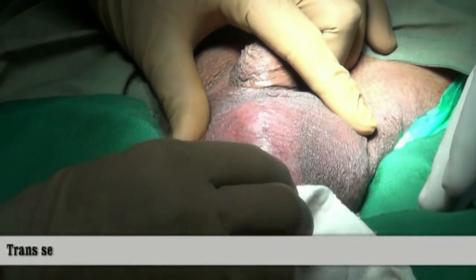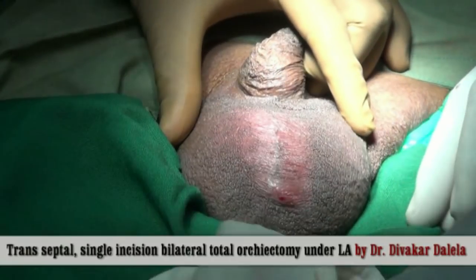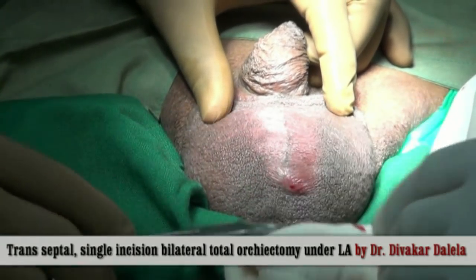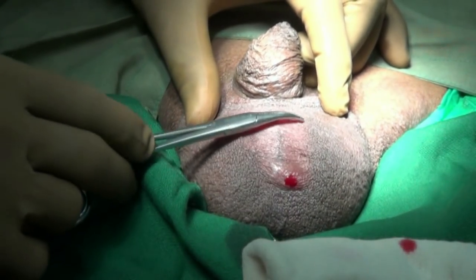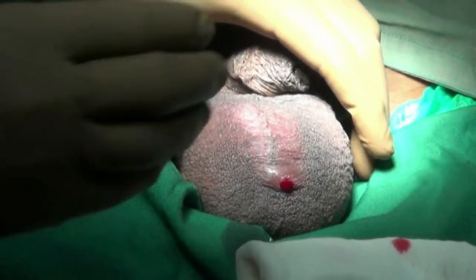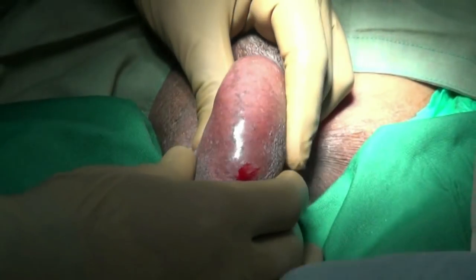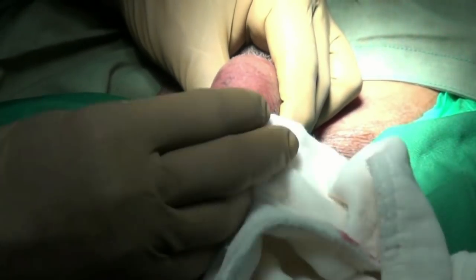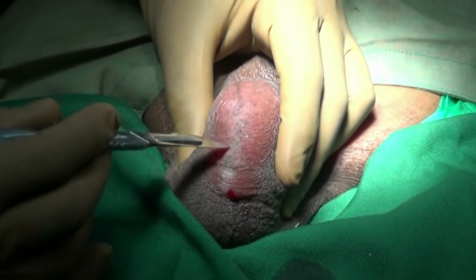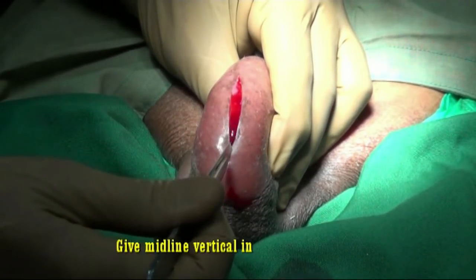I'd like you to have a look again at the area of infiltration in the midline raphe. I hope you can see the patch that has been anesthetized — from here to here — and you can appreciate the change in appearance of the skin. So now we move on and start to give the incision. The testes is brought under the raphe. The black line marks where we will give the incision on the area which has been infiltrated with lignocaine.